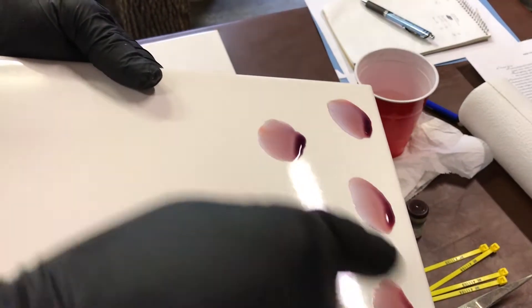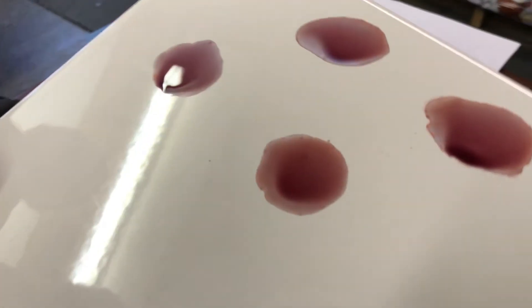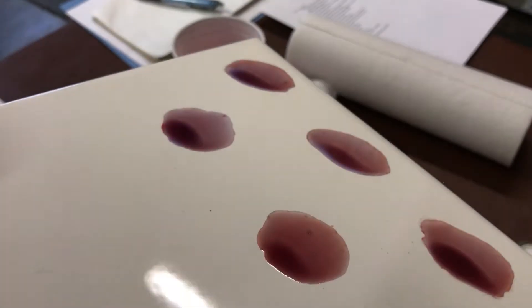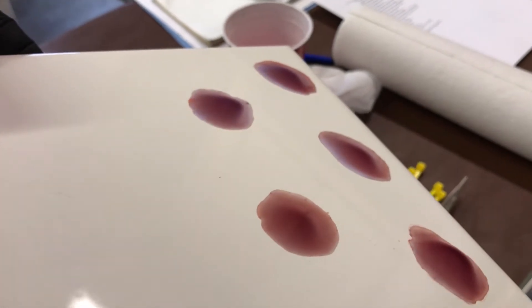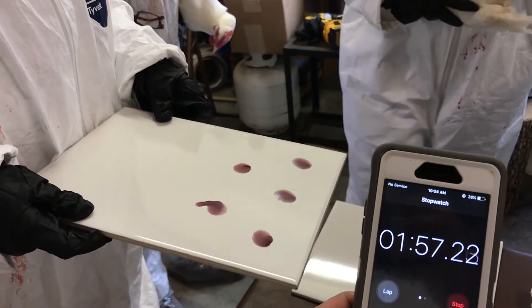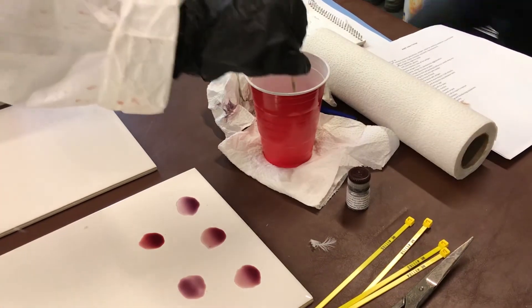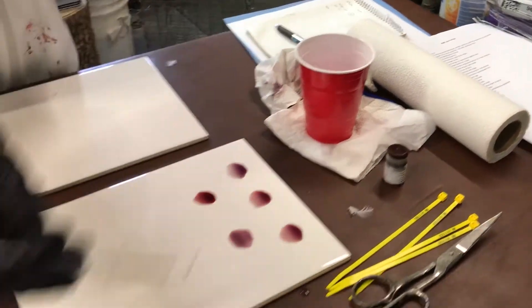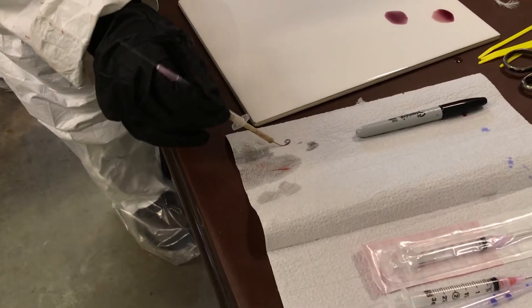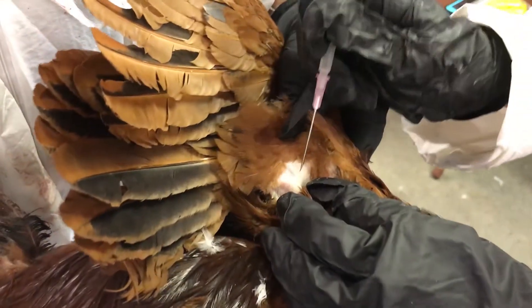Place and identify the bird in a cage while waiting for test results. After about a minute, pick up the plate and gently rotate and observe for agglutination, setting the plate back down. Continue to observe the mixture for a total of two minutes, at which time you will make your final reading. Rinse your loop in water and dry thoroughly on a towel before testing the next bird. You can test another bird while waiting for the two minutes, but make note of the time on the timer so that each test is observed for a full two minutes.